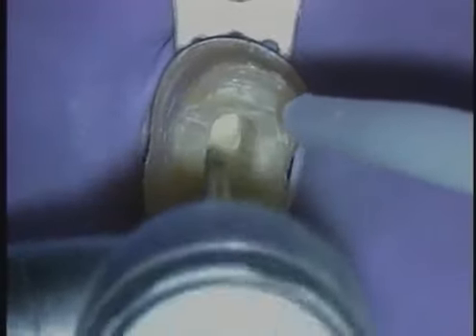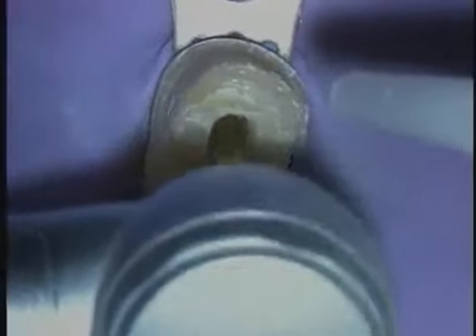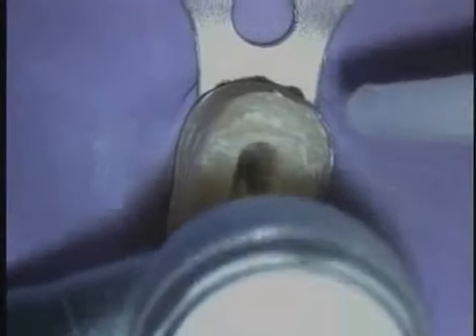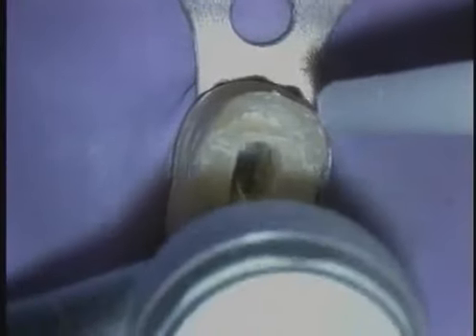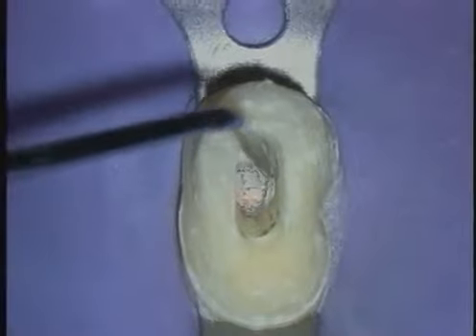Typically, as we work deeper into the tooth, you can see that moving the patient's head subtly allows us to keep that line of sight. We need to be able to move the patient's head so we can keep the handpiece away from our line of vision. The surgical length burrs brush gently away the restoratives, and oftentimes as you get closer to the pulp chamber floor, one has to run the RPMs a little bit slower so we can work our way down to the gutta percha. I think you can begin to see a little pink, and that's always a good sign for a clinician because it means you're on track.